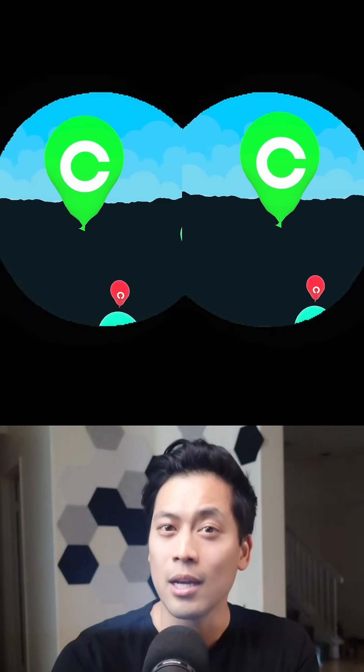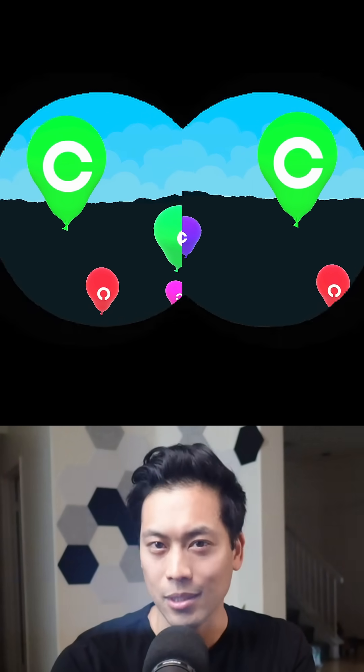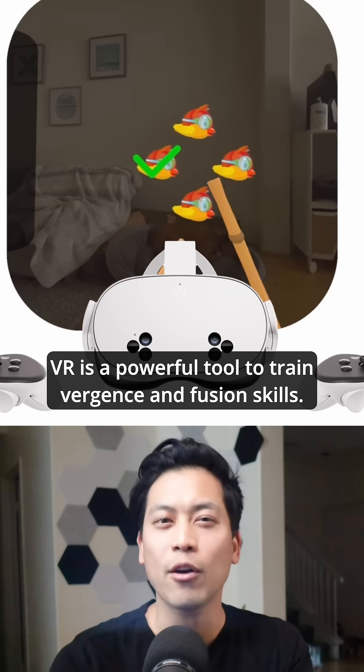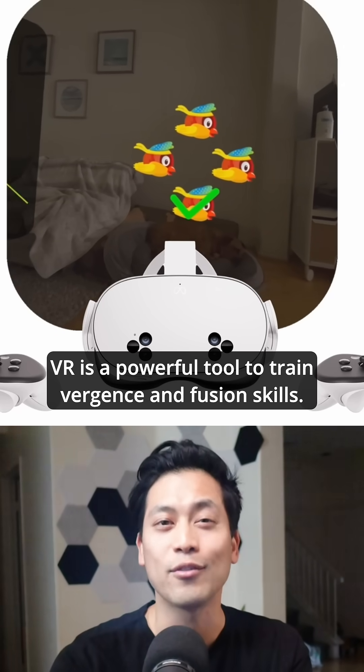By oscillating images horizontally, we can train for improved stereopsis, which is your ability to see in 3D. VR is a powerful tool to train vergence and fusion skills.